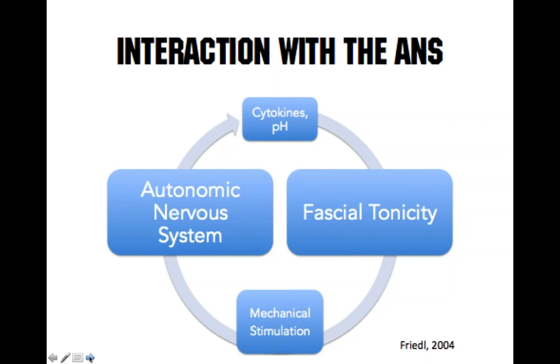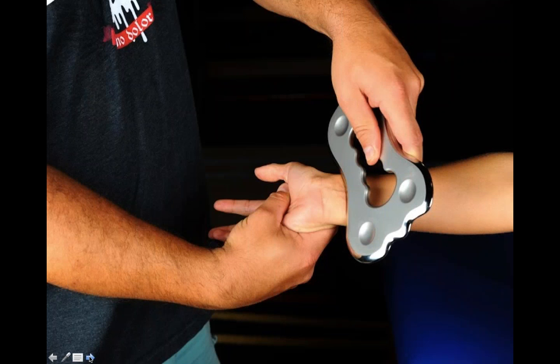And it may not be driven through heavy, heavy pressure. So taking a tool as light as this and feathering certain areas to mitigate pain, giving them some education, and then we can go deeper into the tissue if we feel that's necessary to make the outcome we want. But it shouldn't be the primary driver.